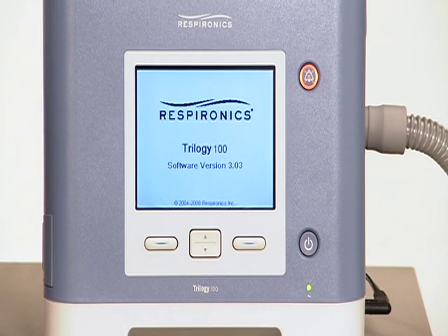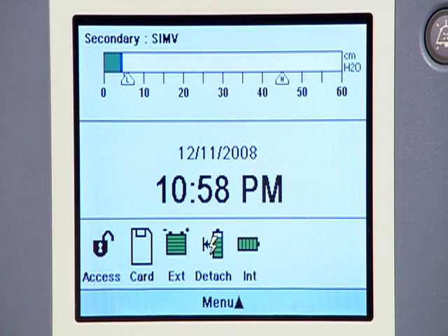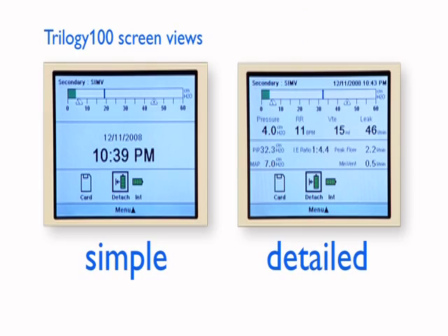A startup screen with Trilogy100 and the software version appears briefly on the display screen. The ventilator returns to the most recently defined ventilator settings, and a monitor screen appears. The appearance of this screen may vary depending upon how your clinician has set up your device. Trilogy100 has a simple and a detailed screen view. Please select the screen view that looks most like yours.